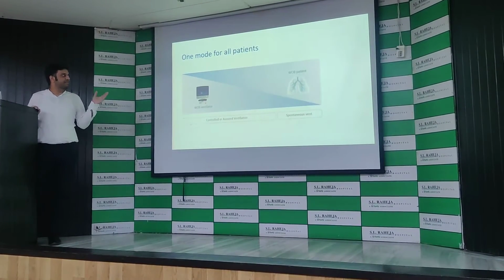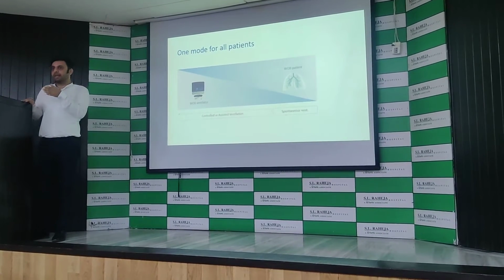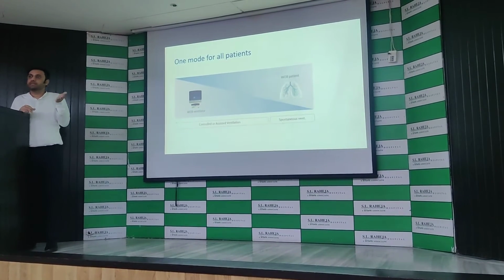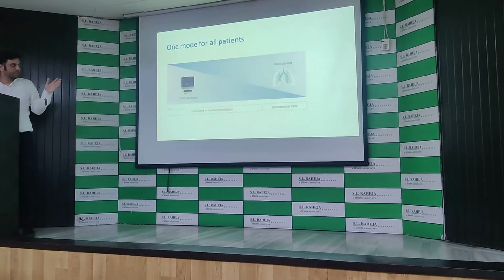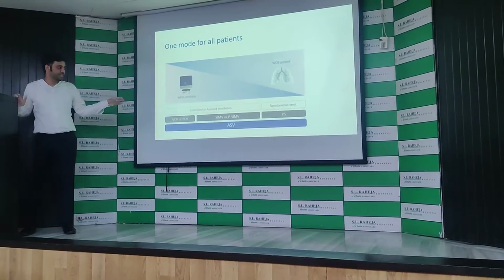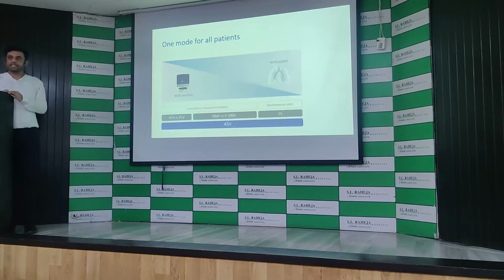As I said, when we talk about ASV, for a passive patient it is a volume targeted pressure control, but for an active patient it is a volume targeted pressure support. This is how it exactly works in ASV for all the patients, whether in control, assisted or spontaneous ventilation. This is how they have mentioned that VCV or PCV or SIMV or PSIMV or support, all exactly combine and work as ASV.